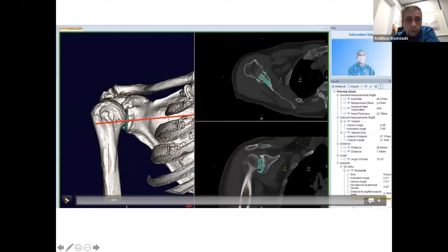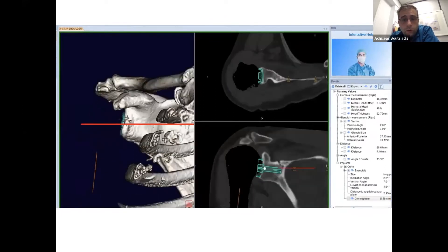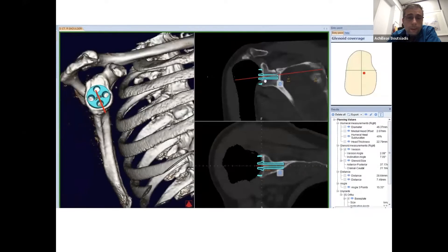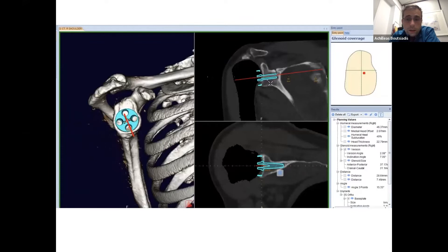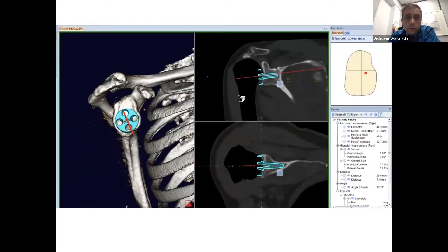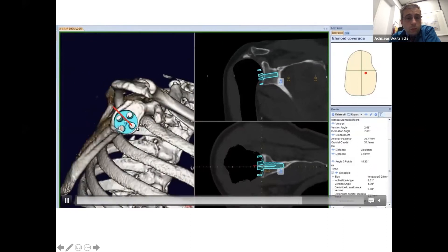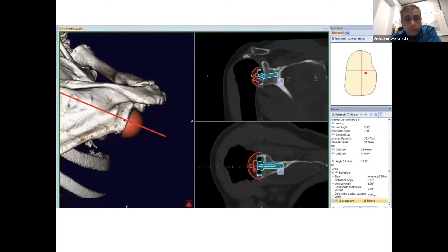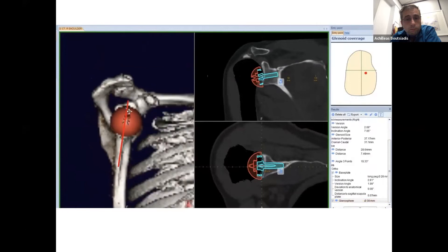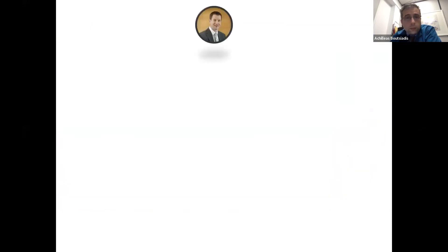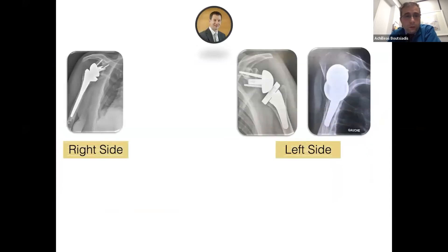Let's place our implant. In this case, we use an implant without any posterior metal. We can choose its position to correct it to the right side, and we can see the correction and the angles being corrected during implant positioning. We see that superiorly there is a slight defect, so we'll probably have to fill this with a small bony part. Working with the team in Grenoble four years ago, we compared a Grammont prosthesis on one side versus a new prosthesis with a bio-RSA correcting deformities on the other. We expected better results with the new prosthesis, but we had the opposite.